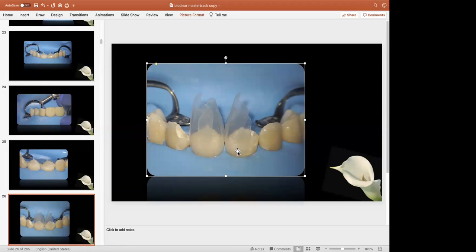That matrix is called a shield or a shepherd matrix. What this matrix does is prevent the other matrix from coming into the space of the adjacent tooth. That is a very important step which we often miss, and then our proportions go wrong.